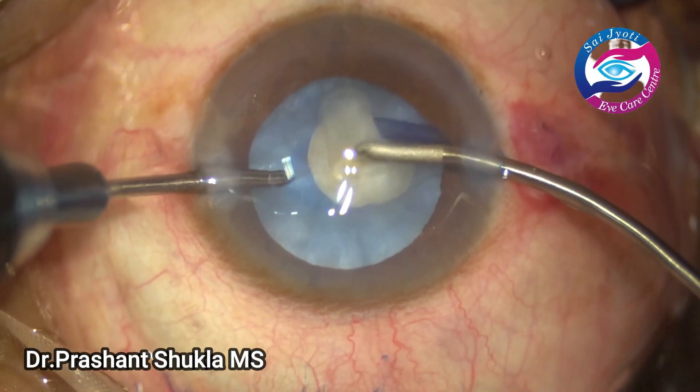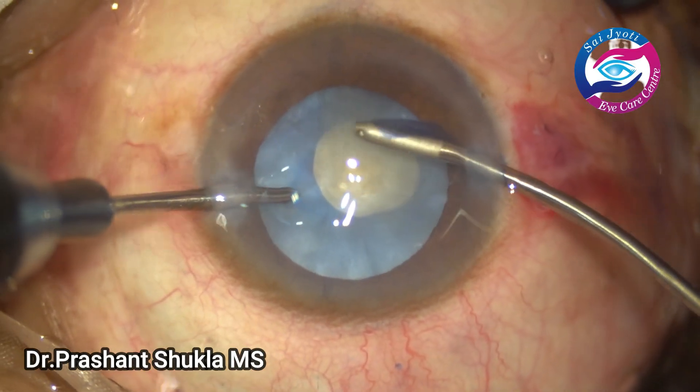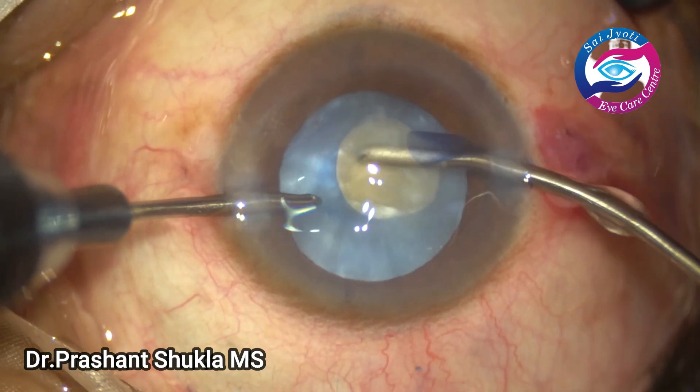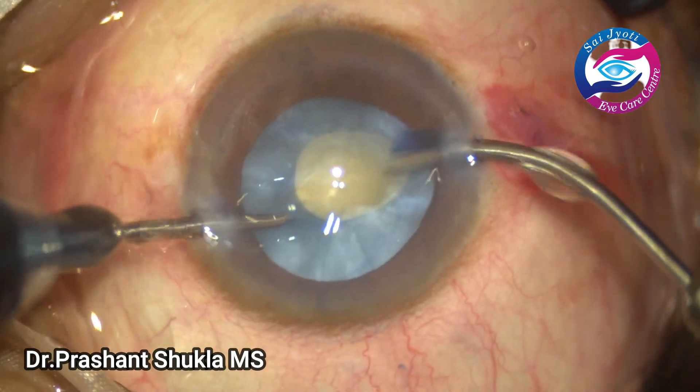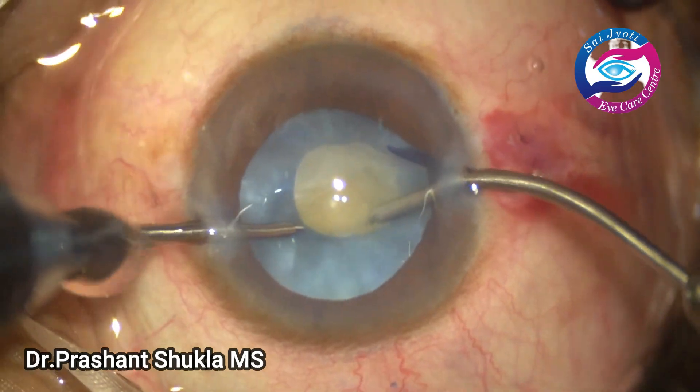A small rhexis has been made and now is the time to decompress the capsular bag. Here I am using bimanual with vacuum of about 300 and bottle height about 100.